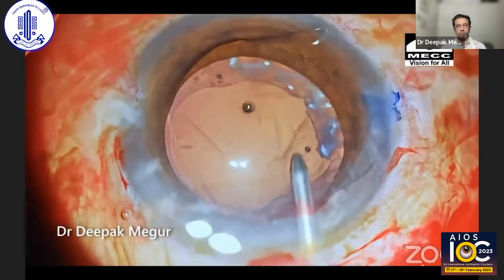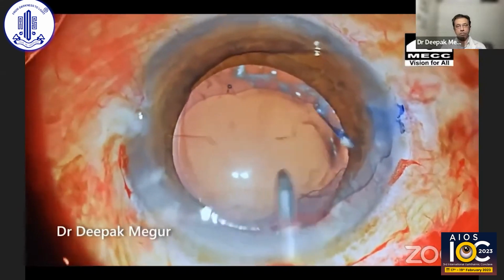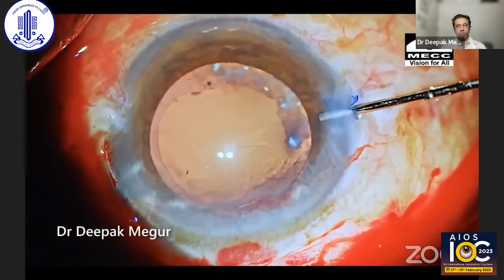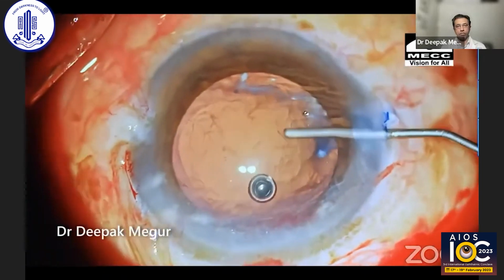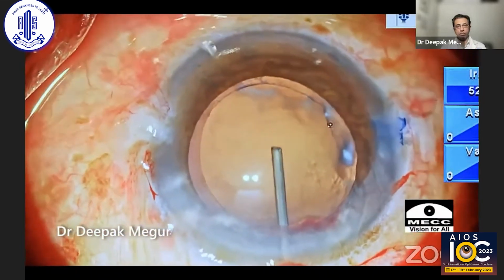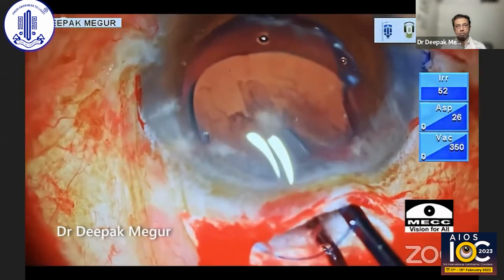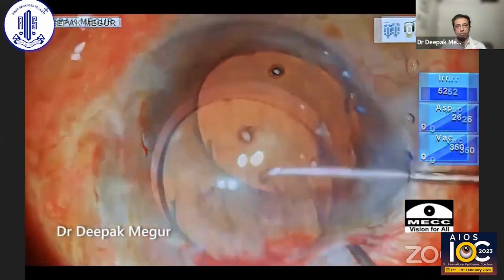Gentle irrigation is being done to flush out any remaining cortex. There's hardly any. The bag is now being filled with sodium hyaluronate so that space is created inside the bag, and then I'm planning to implant the multi-piece lens into the bag.